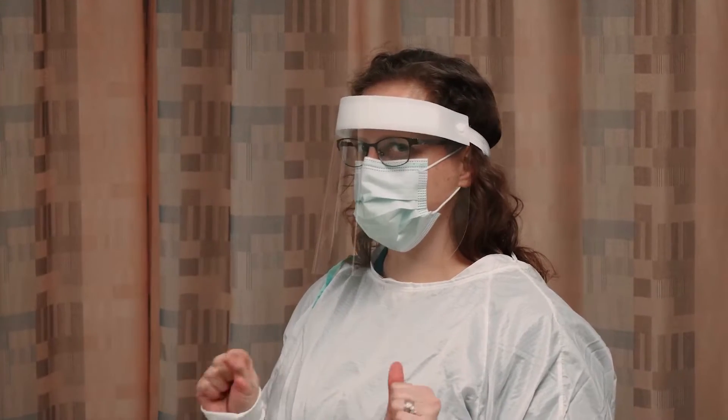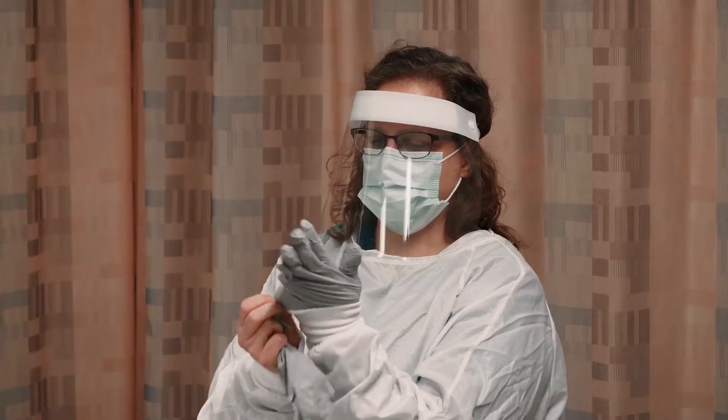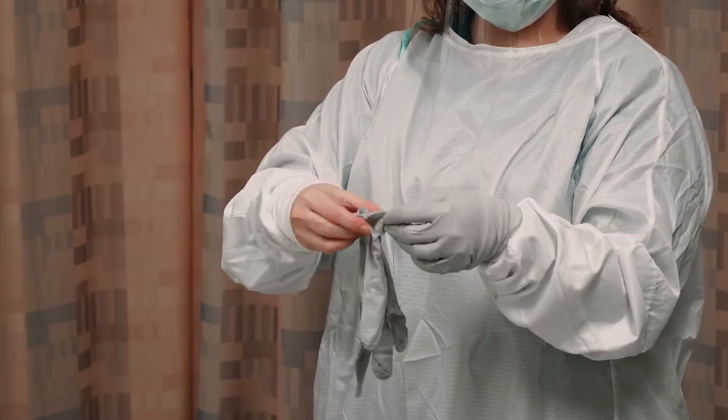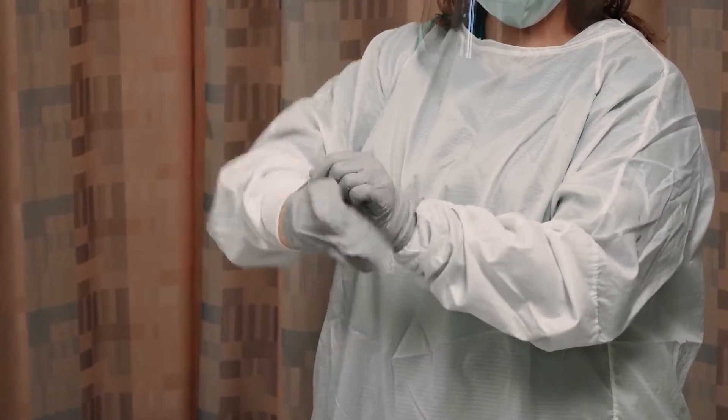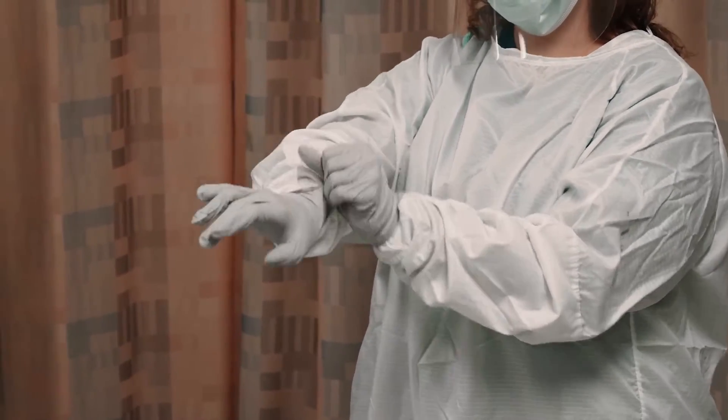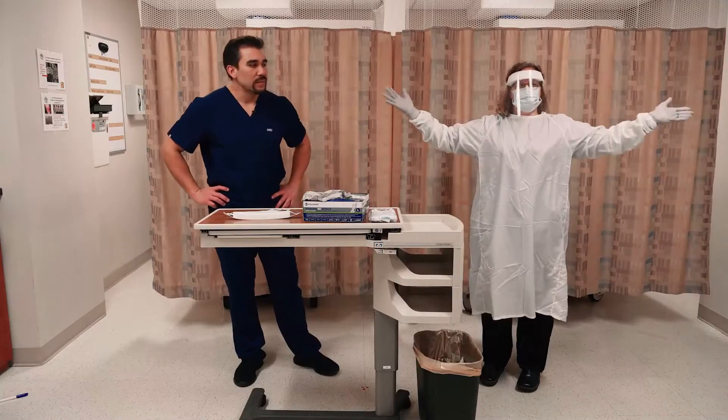Now the last one is the glove. One of the biggest key takeaway points is the gloves go over the ends of the sleeves of the gown. We want to make sure that we're aseptic — we don't want anything leaking in there. If anything gets splashed on us, we want it to be on the outside.